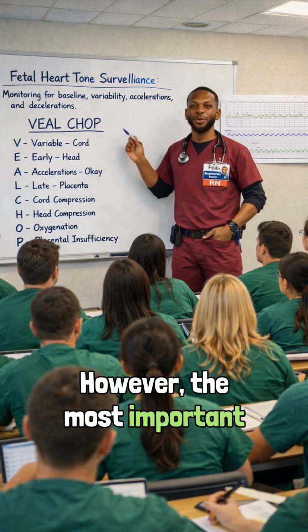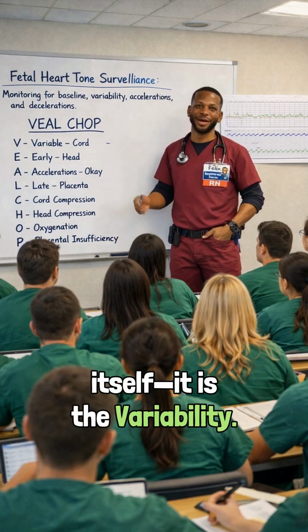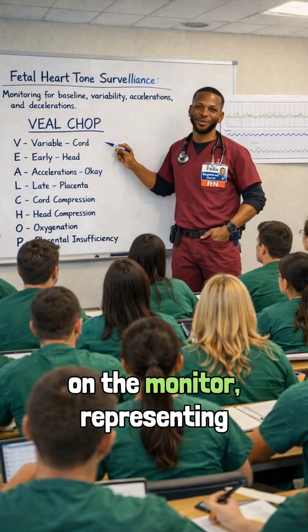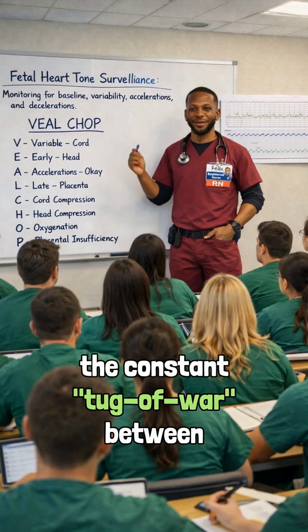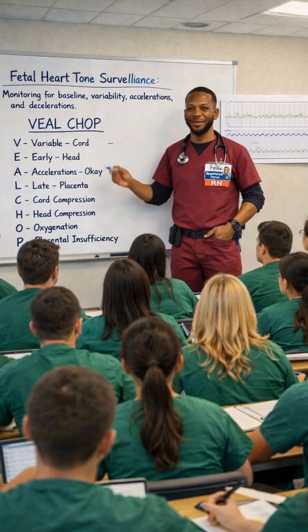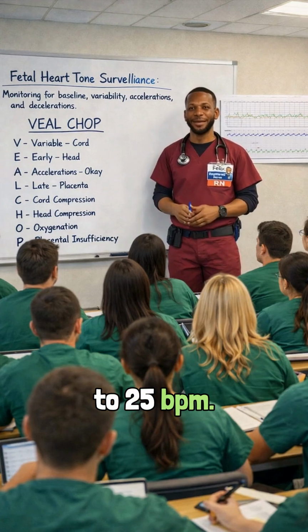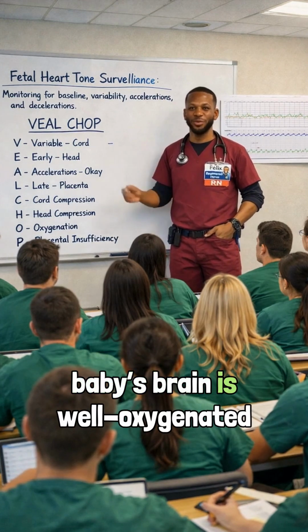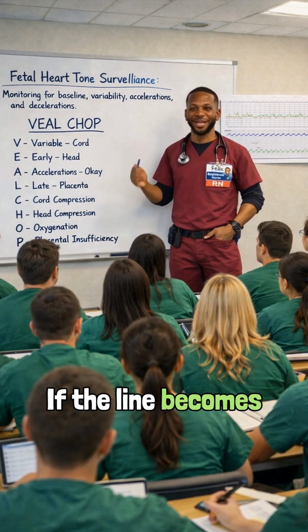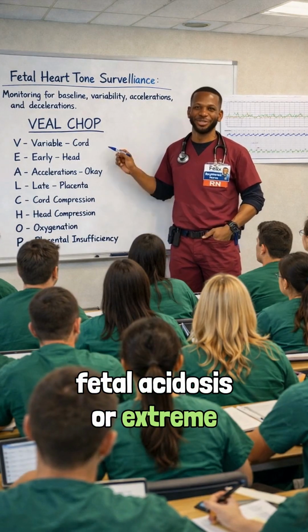However, the most important predictor of fetal oxygenation isn't actually the rate itself, it is the variability. Variability refers to the jaggedness of the line on the monitor, representing the constant tug of war between the sympathetic and parasympathetic nervous systems. We want to see moderate variability, which is a fluctuation of 6 to 25 BPM. This tells us the baby's brain is well oxygenated and the neurological system is intact. If the line becomes flat or absent, we are deeply concerned about fetal acidosis or extreme exhaustion.